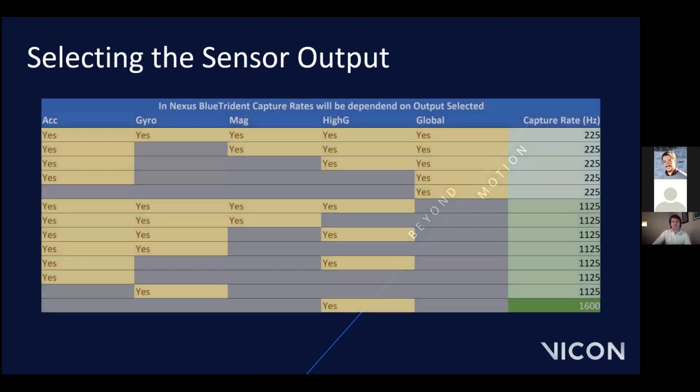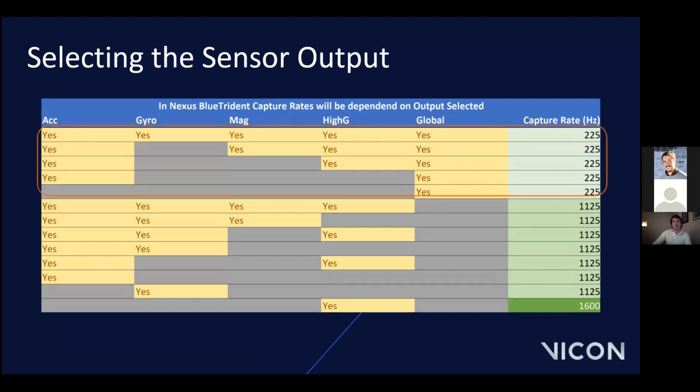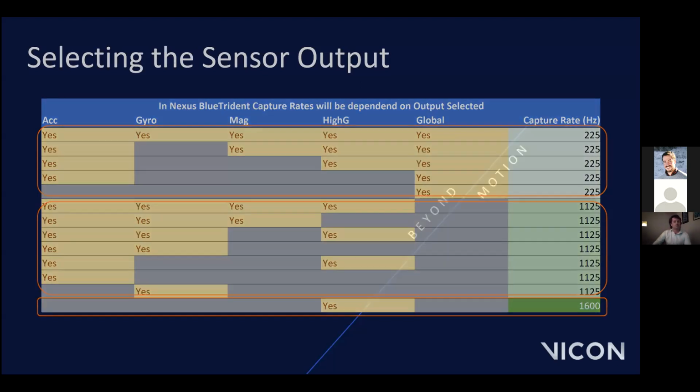So this table just takes us through how the capture frequency adjusts based on what components you include. As you can see, when global angles are included in the output frequency, the capture rate is 225 Hertz. When we remove the global angles, this then increases to 1,125 Hertz. And finally, if you're only capturing the high G sensor, then this is recorded at 1,600 Hertz. So it's really important that you know which components you're interested in and just make sure you're selecting the ones that are valid for your research.